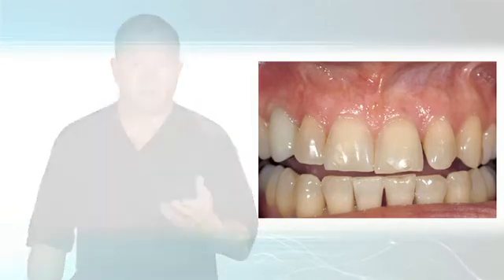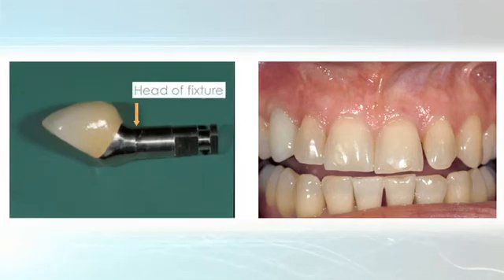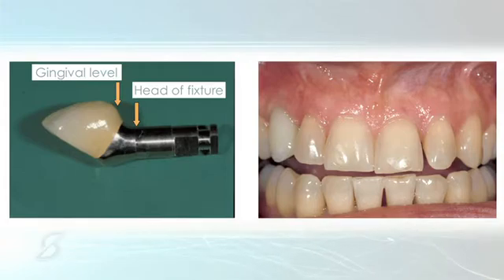And here's the same patient 4 weeks later, and now that same restoration now has a gingival level that matches the left canine. All of it created by contour, none of it created surgically. And if you want to know how it does long term, here's the final restoration. And the final restoration very much mimics what I did with the composite. And it actually is a screw retained final restoration. But once you've got your tissue molded, it's quite easy to create an abutment with a margin just 1.5 millimeters below tissue and do a cemented crown, because it's easy. There's no pressure in the way then.